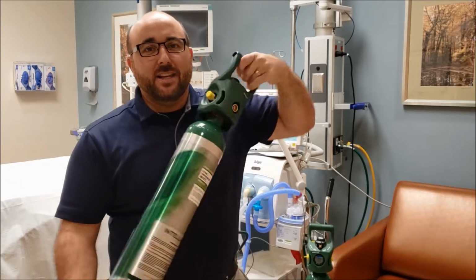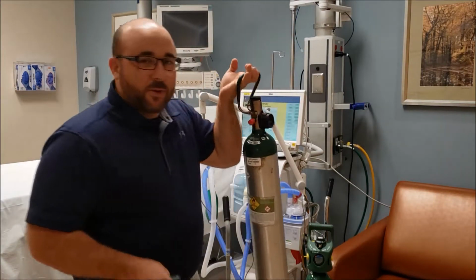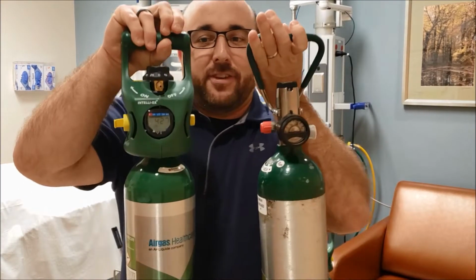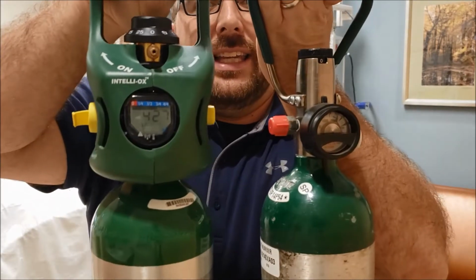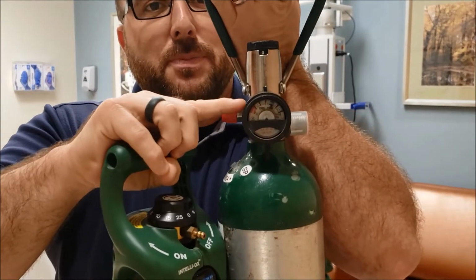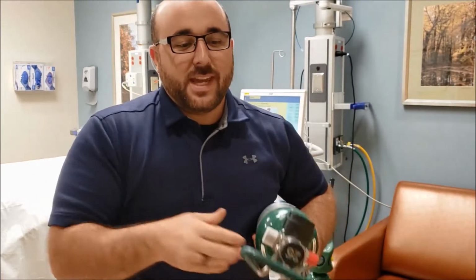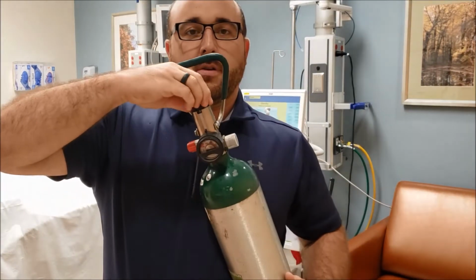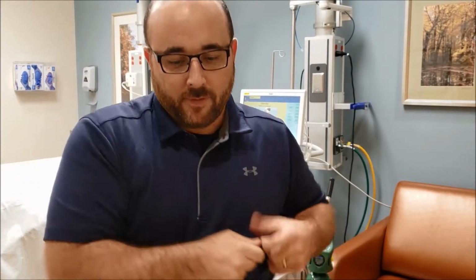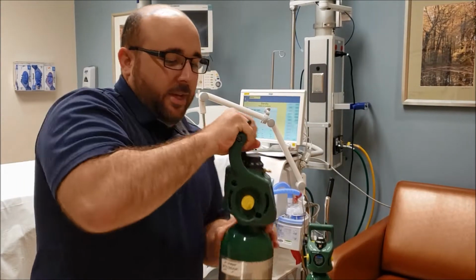The Intelliox tank is an E-cylinder, just like you would normally see right here. You'll see the big difference is Intelliox on this side actually has a liters measurement, where this has pressure per square inch. The top of these tanks work just the same. You'll adjust the flow right here, and you'll adjust the flow right there.